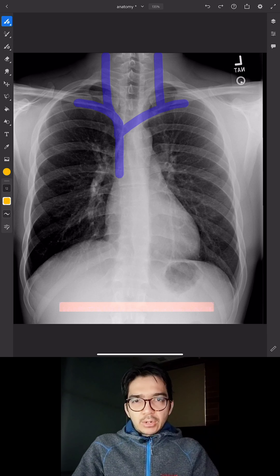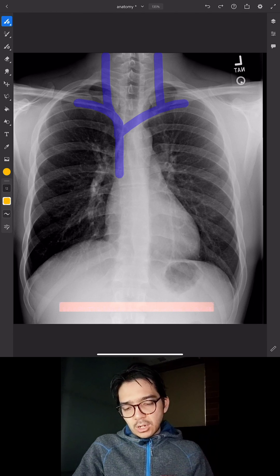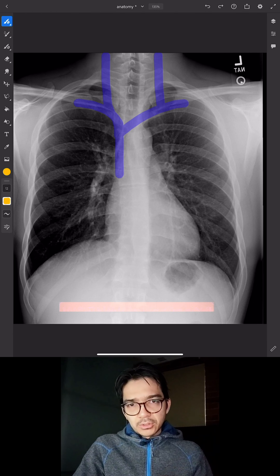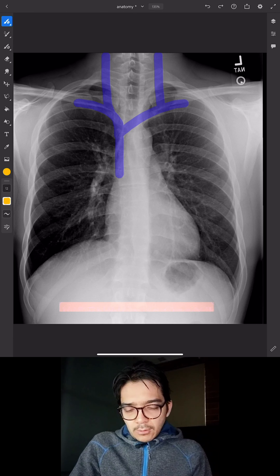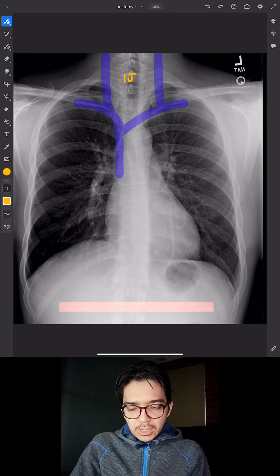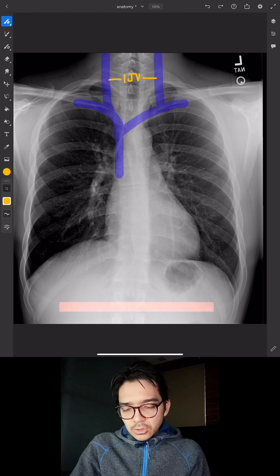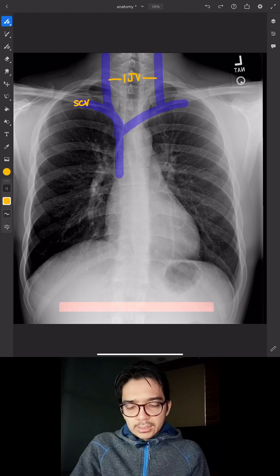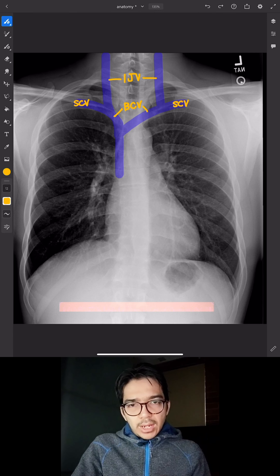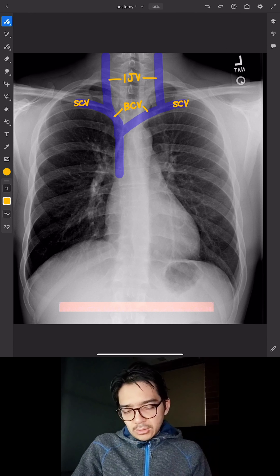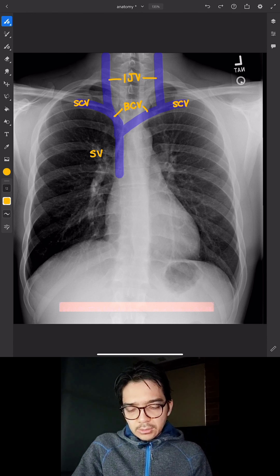We need to first start out with the anatomy. I have a chest x-ray here and I've drawn in a diagram of the major vessels that you need to know. The internal jugular veins join with the right and left subclavian veins to form the right and left brachiocephalic veins, which then join together to form the SVC.